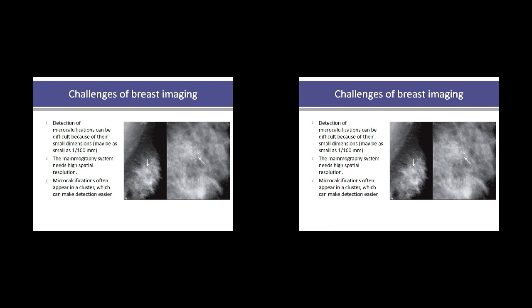On the plus point, microcalcifications often appear in a cluster, which can make detection easier. So you're not looking for a single speck. If you have a single speck, it's probably dust on your image. You're looking for a cluster of them.